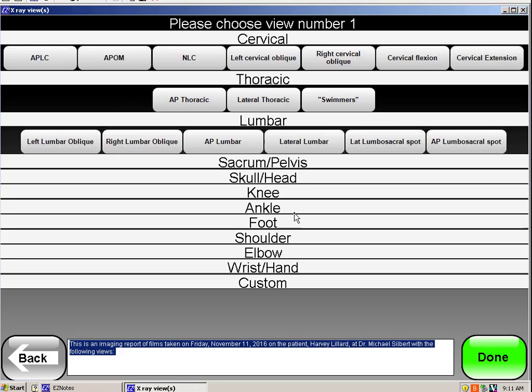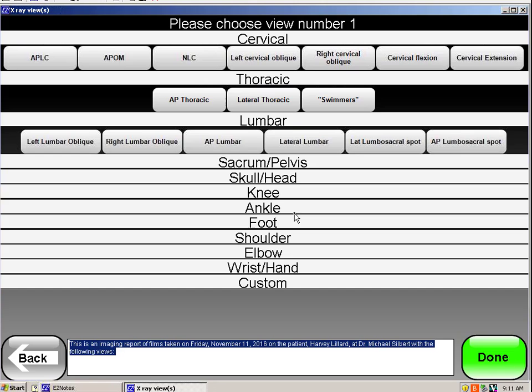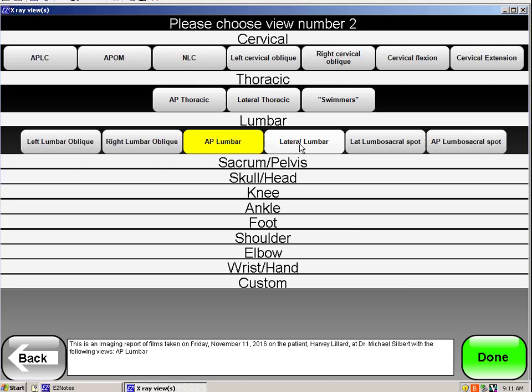Now you're going to indicate what views were taken. So let's say in our discussion about Harvey Lillard hurting his back, I might have shot an anterior-posterior lumbar and a lateral lumbar, and then I say done.